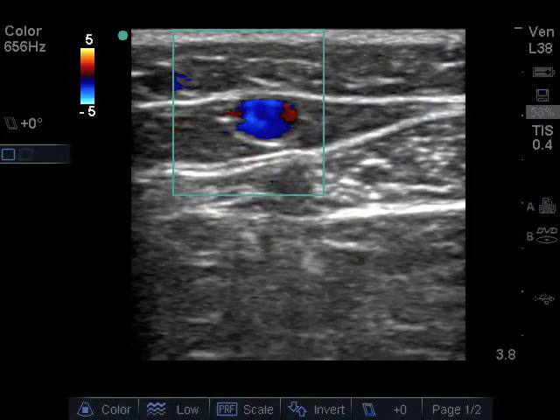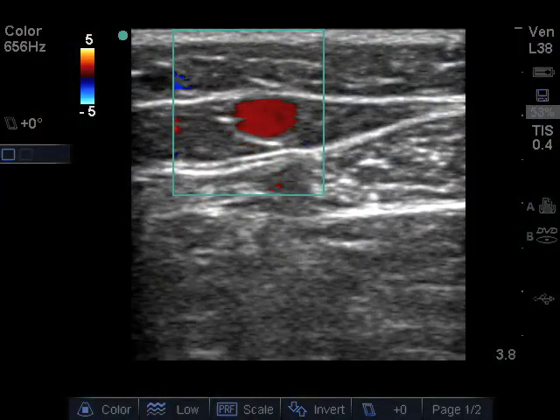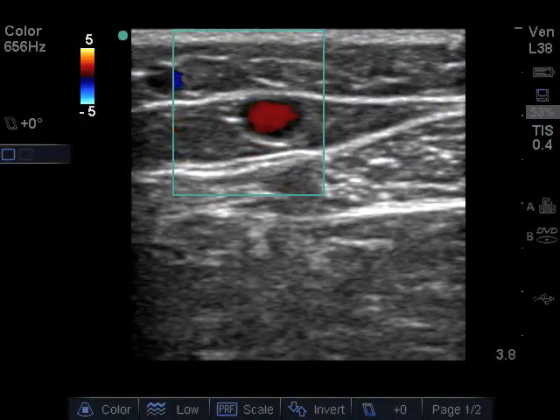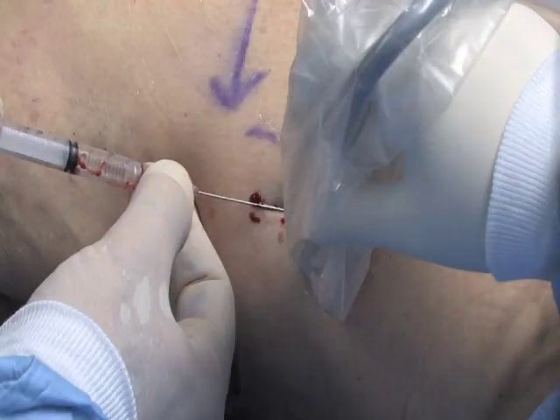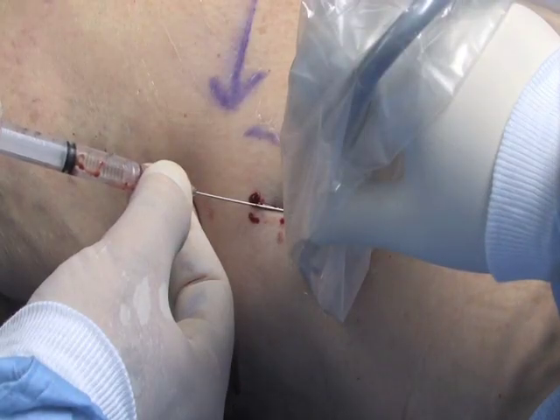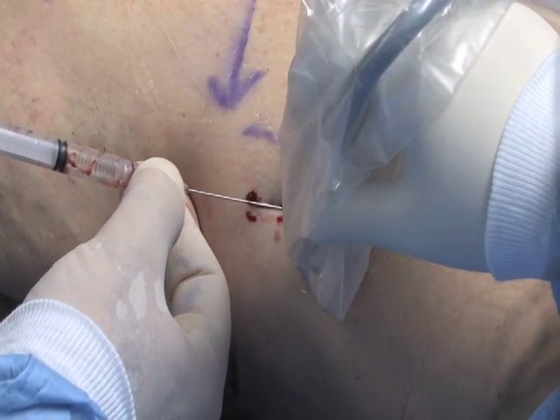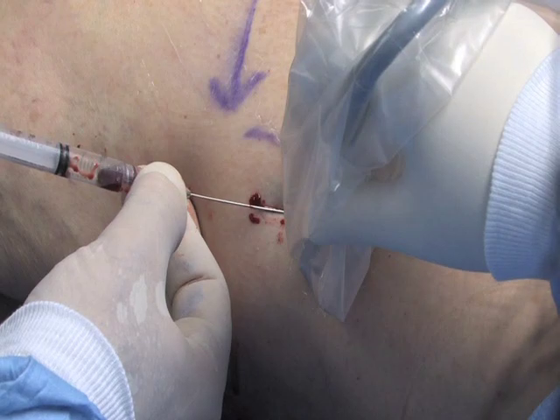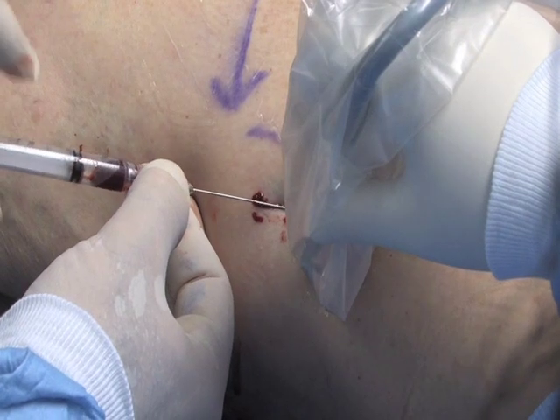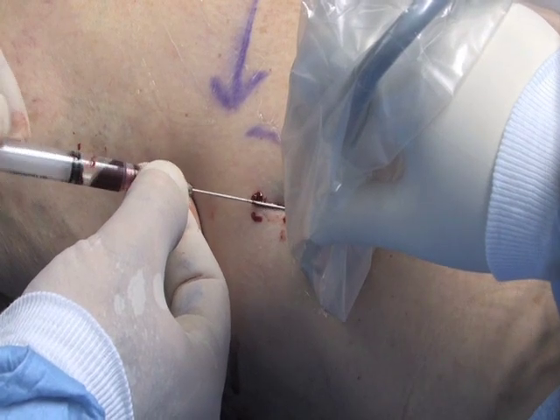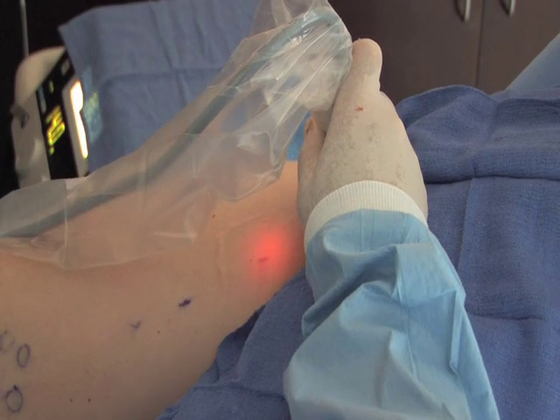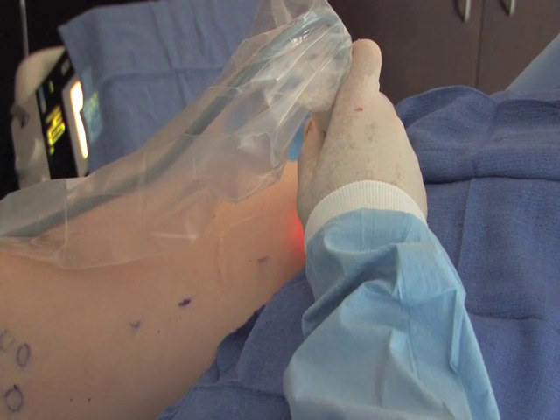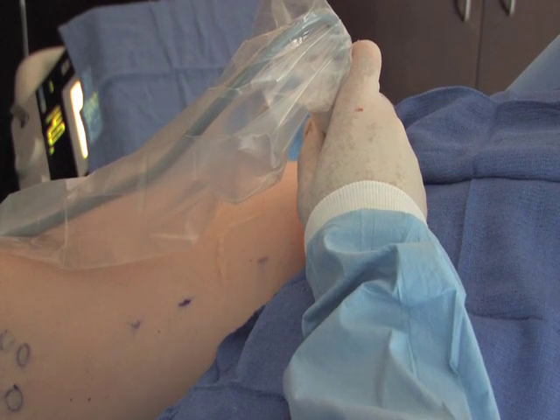Ultrasound enables assessment of the superficial venous system of the lower extremities and allows for direct visualization of the introducer sheath and laser fiber during initial insertion into the vein and while advancing the sheath and laser fiber towards the proximal greater saphenous vein.